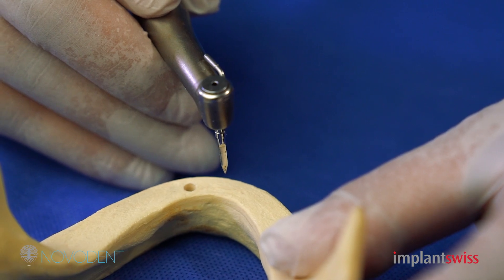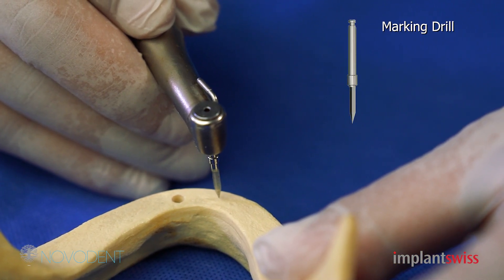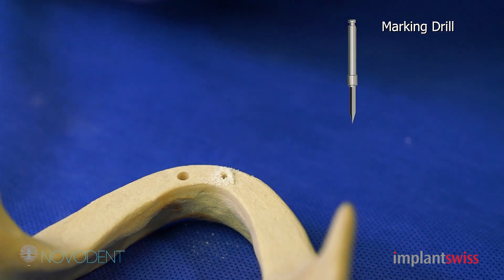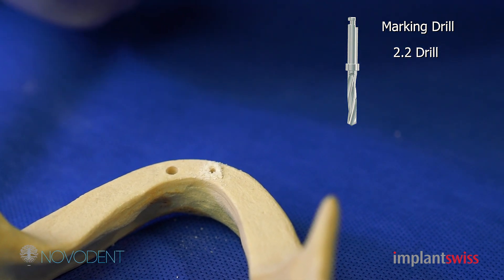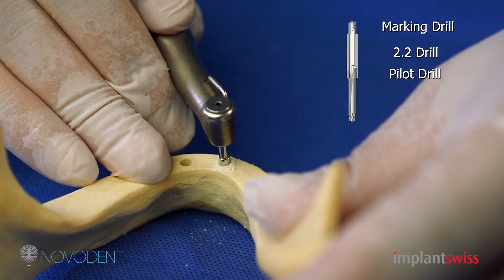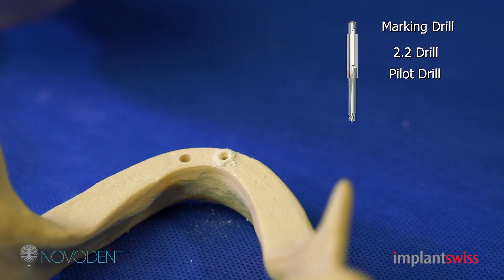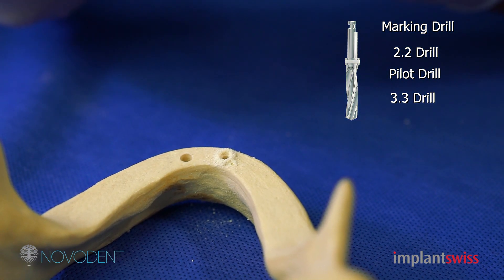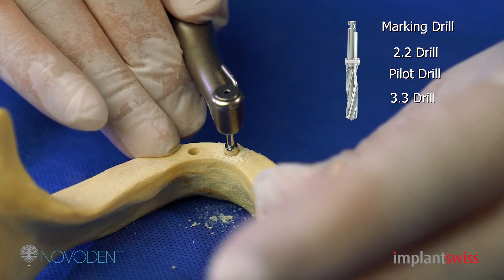The sequence of drilling is the following. First of all, you get the marking drill and you drill where you decide to place your implant all the way down. Then you will get the pilot drill, which is according to the length of the implant you are using, and it will stop by itself, as you can see here. We finished with the pilot drill, and now we go to the fixture drill. We start with the 3.3 drill and you drill all the way down, as you can see here.